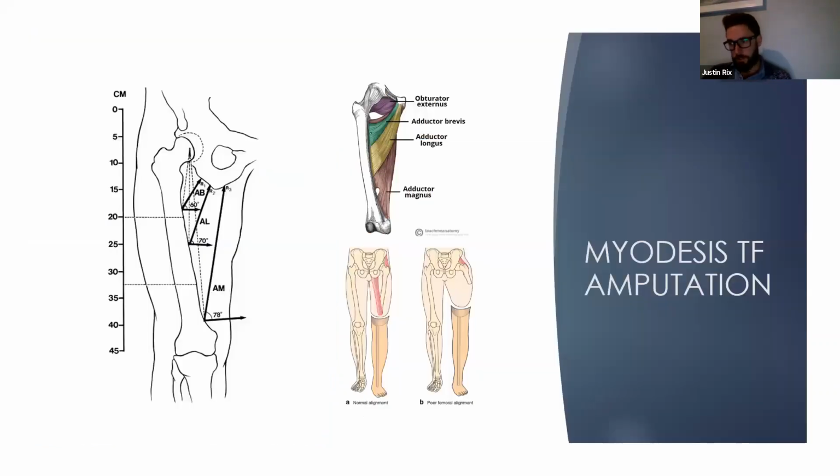This slide, I think Maritz covered very much the same. If we're looking at this picture over here, this is a lady, and it's a prime example of what we had with that lady, where they had a very short femur and lots of residual soft tissue. What ends up happening is that we have limited control of the residuum inside the socket, because it's taken away a lot of the stabilizers. This affects alignment, and we start losing control of the lever.